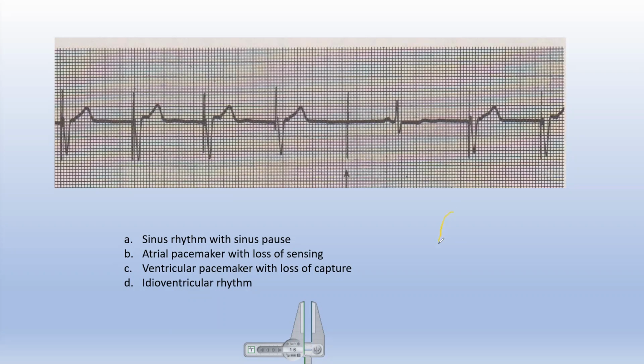So supposing now that this is the pacemaker lead, and sometimes with the pacemaker being with the patient for a long time, scar tissue might cover this particular electrode. And if you cover that electrode with scar tissue, therefore, electricity will not be able to come out of that electrode in a normal fashion. And therefore, it will cause intermittent loss of capture.